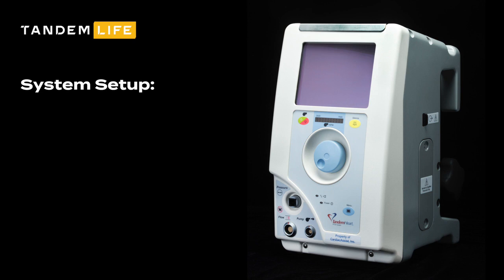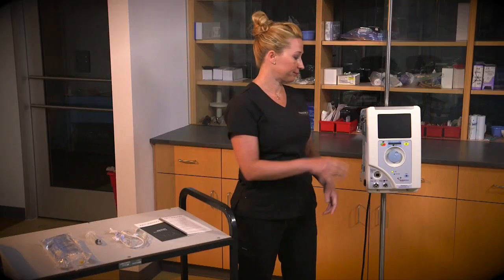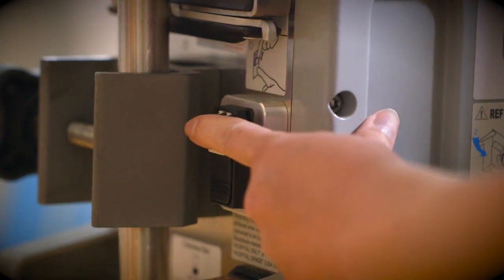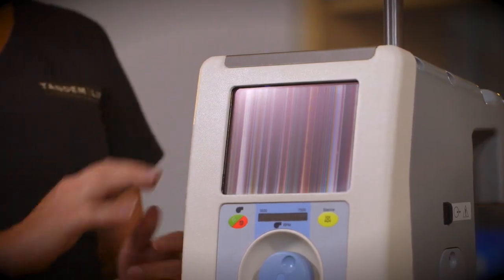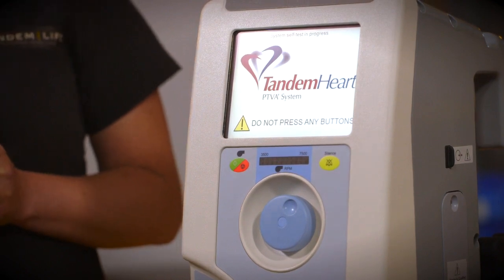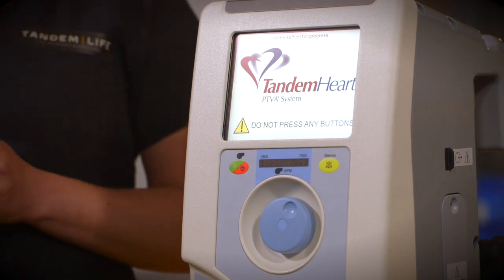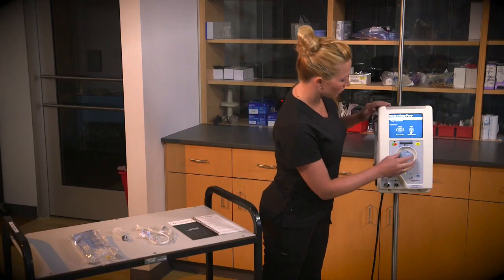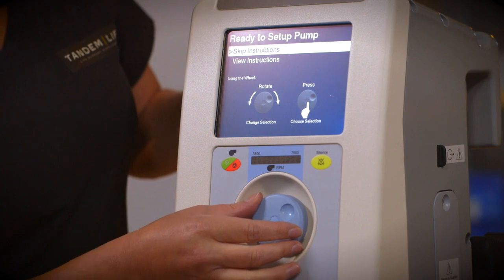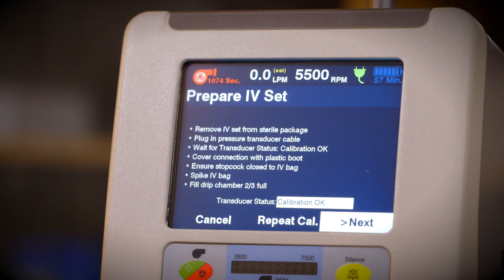Infusate priming is critical to the proper operation of the Tandem Life system. Priming procedures must be followed carefully. First, power up the controller. This procedure will take approximately 45 seconds to one minute to complete. Do not interrupt the procedure by pressing buttons on the control panel. Allow the system to fully power up before continuing. The controller is ready for operation once the View and Skip menu screen appears. Select View Instructions for an on-screen tutorial of the setup procedure.